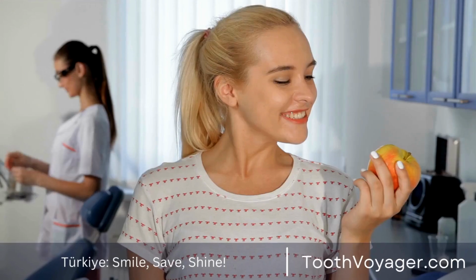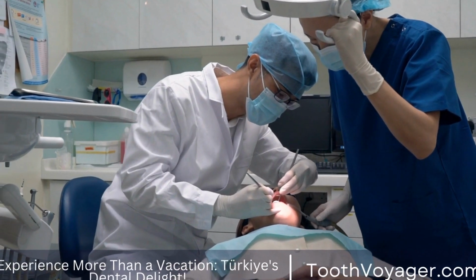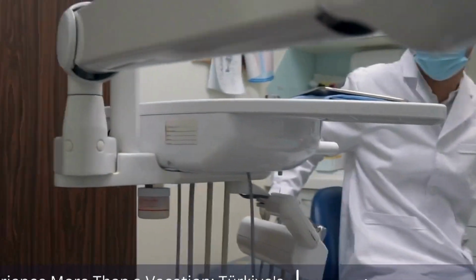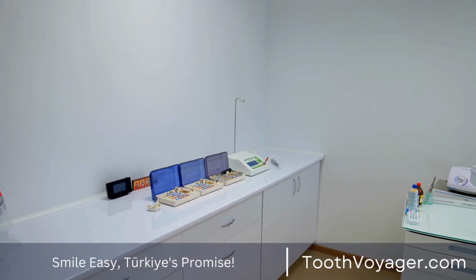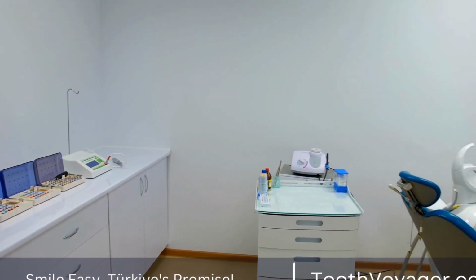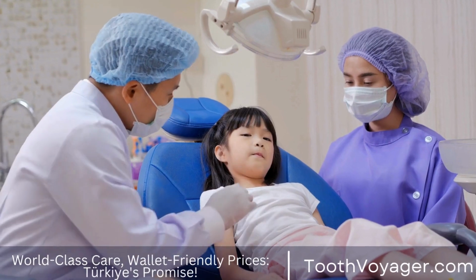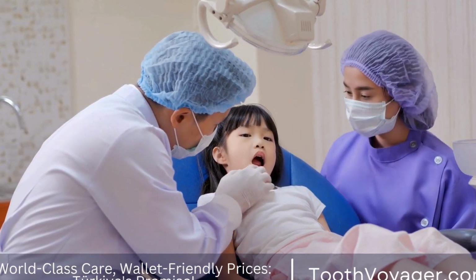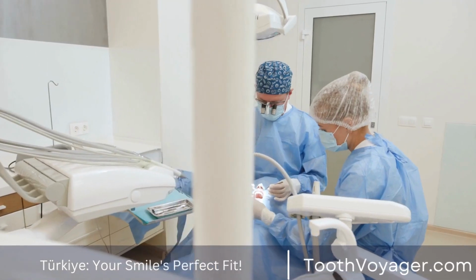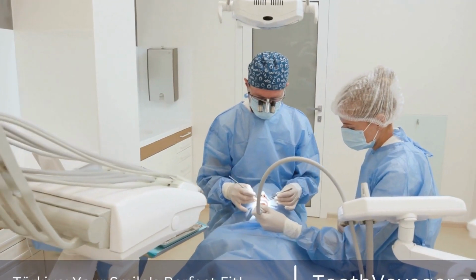4. Implant-supported dentures. Implant-supported dentures are a kind of denture that is held by dental implants rather than resting on the gums, as with conventional dentures. This can provide more stability and a secure fit, which reduces the possibility of slippage and discomfort when eating and talking. Implant-supported dentures are either removable or fixed, based on the individual's requirements and choice. Dentures are commonly employed to replace many teeth or entire dental arches and increase the functionality as well as the appearance of the mouth.